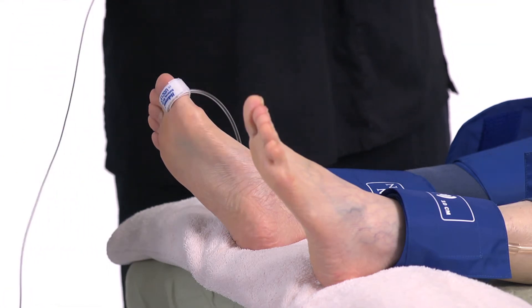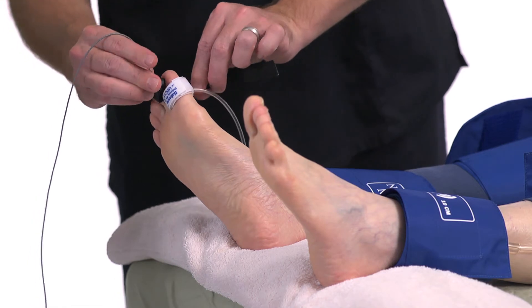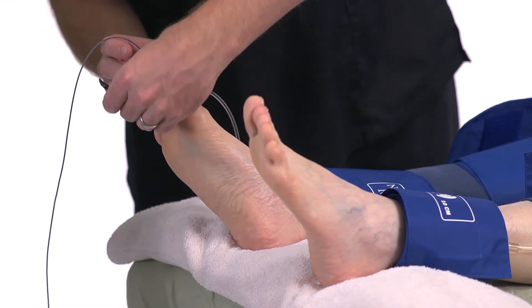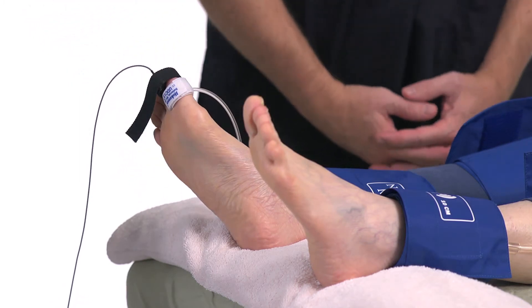You must be able to get a PPG pulse in order to obtain a toe pressure. You can obtain a toe pressure with a Doppler, but it is more difficult as the digit arterial signal is not easy to obtain.